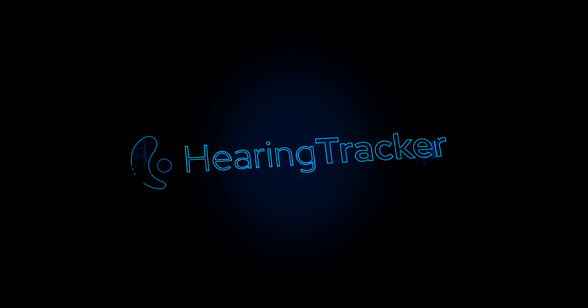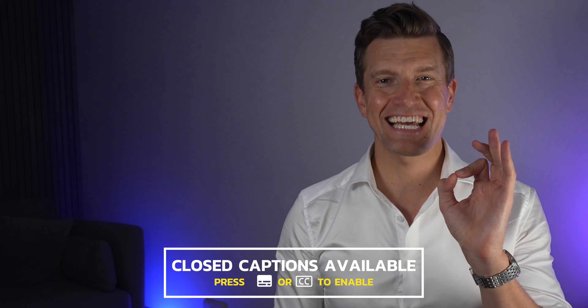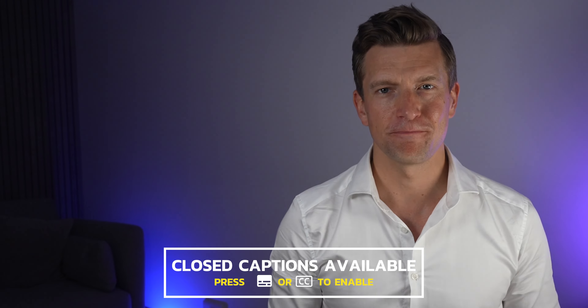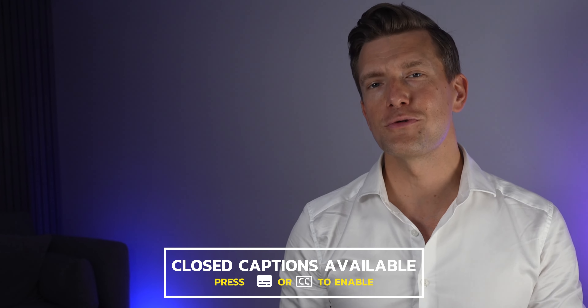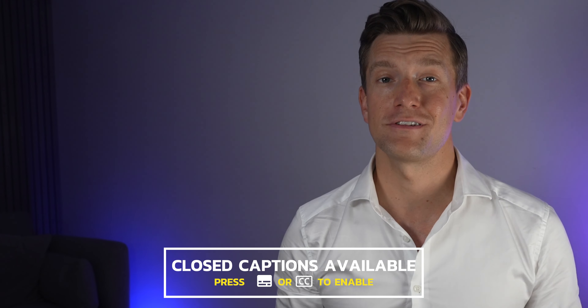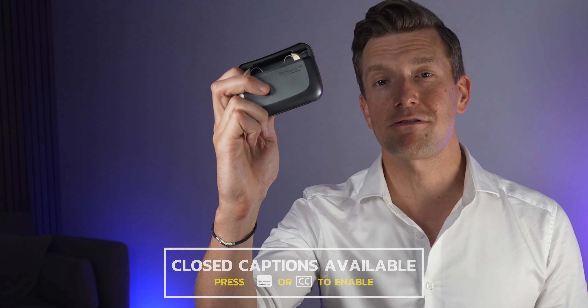Hey guys, it's Matthew here from Hearing Tracker, keeping you up to date with all new hearing aid technology. In this video, I'm covering news which is hot off the press regarding ReSound's brand new receiver in canal Omnia hearing aids, of which the main focus is better understanding of speech in background noise.